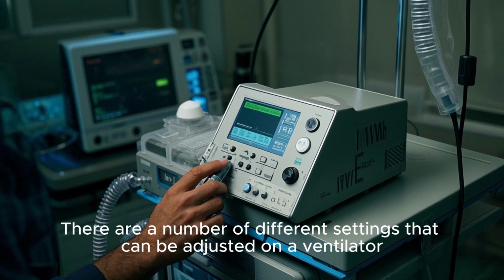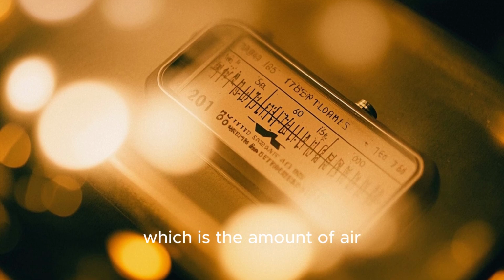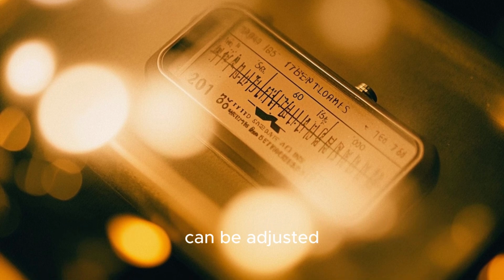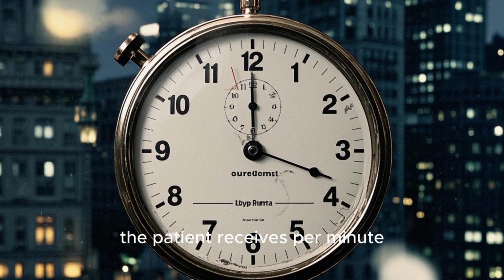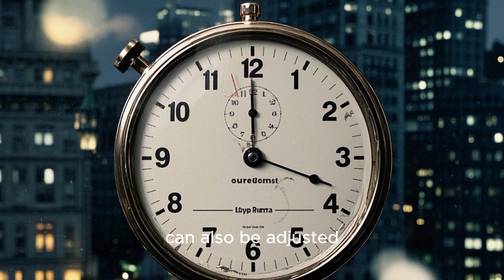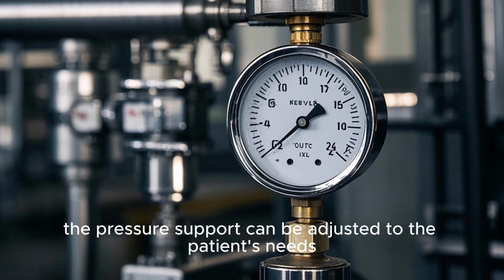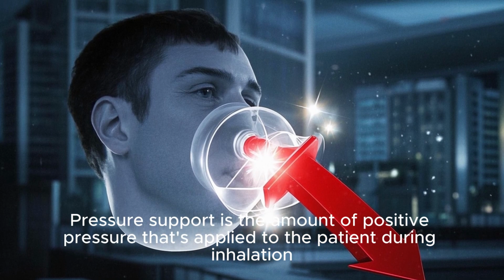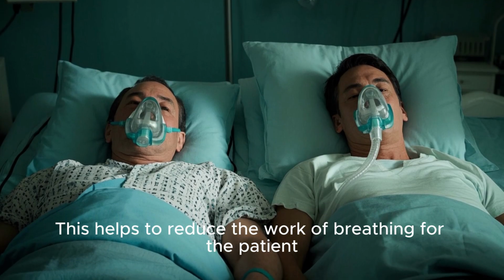There are a number of different settings that can be adjusted on a ventilator. The tidal volume, which is the amount of air that's delivered to the patient with each breath, can be adjusted. The respiratory rate, which is the number of breaths the patient receives per minute, can also be adjusted. Additionally, the pressure support can be adjusted to the patient's needs. Pressure support is the amount of positive pressure that's applied to the patient during inhalation. This helps to reduce the work of breathing for the patient.